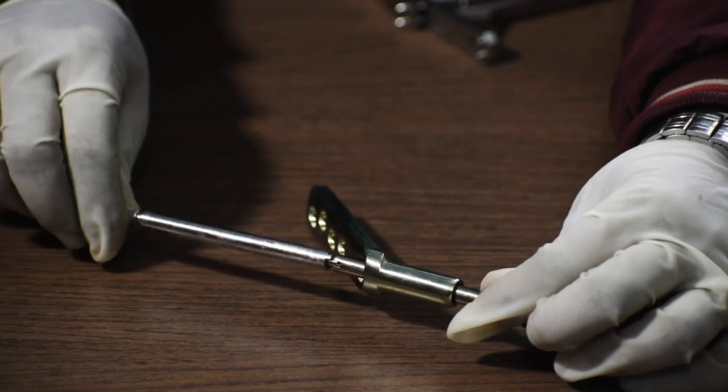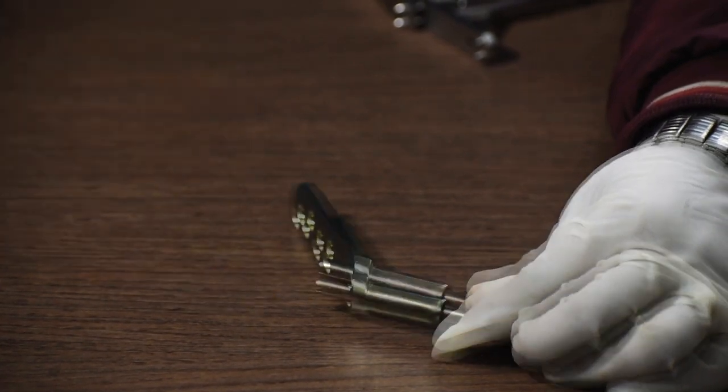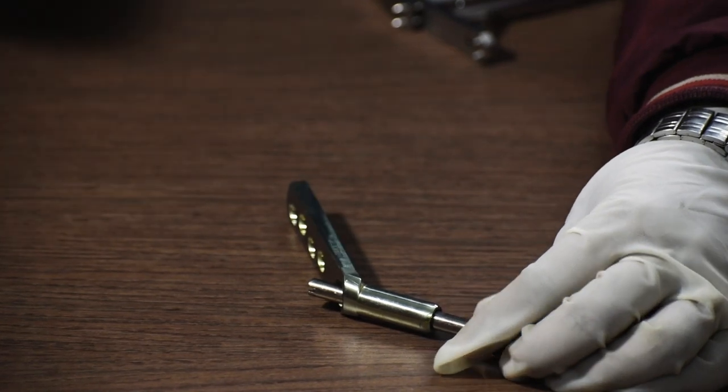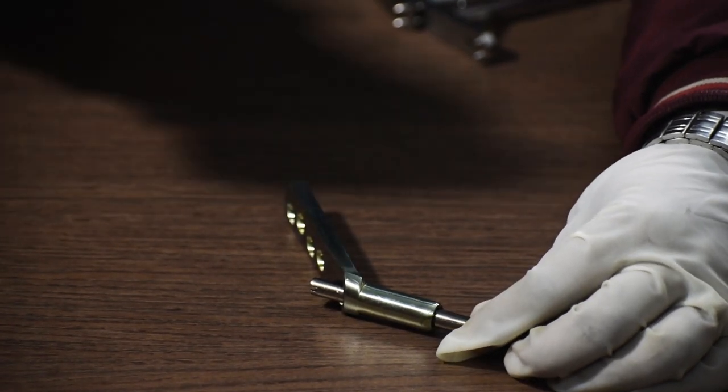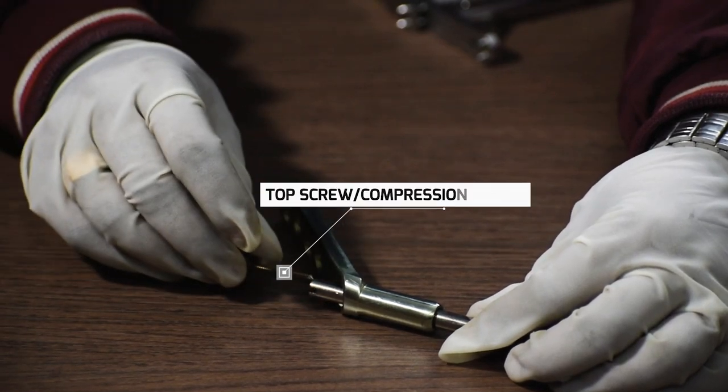Now after the plate goes in, we will remove this plate holder and we will just place the top screw or the compression screw on top of the lag screw and we will not tighten it yet right away.